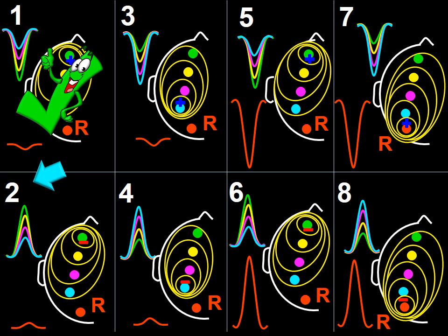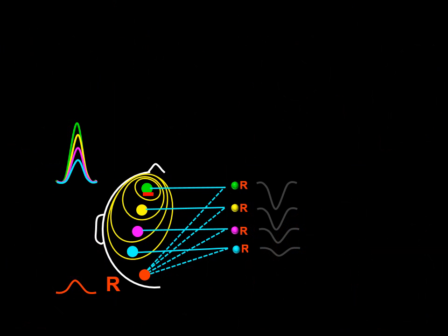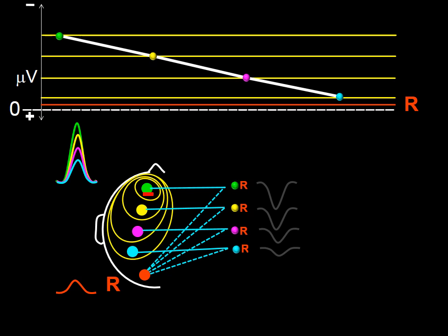Next, we need to ask ourselves whether the second option is a sound option or it is not. In this frame, I have introduced the appropriate isopotential map with its corresponding waves, and by the side in gray, the cartoonish representation of the waves in question. Now I have introduced the voltage graph corresponding with the isopotential map.